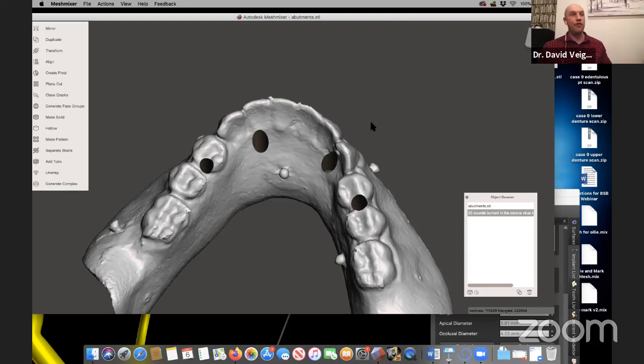I've been in surgeries where I just physically take the denture and tape it onto the bite fork, or anything just to position it in the right position. But most modern day scanners will have a little plate that you can just set the denture on top of, and it will scan it. And that's actually quite important, because you want the plate to be not radio opaque, because if it's radio opaque, it will pick up that bit and it might obscure the fitting surface of the denture. So you need to sit it on something that's relatively radiolucent, like some tissue or something if you don't have the little bit of foam.